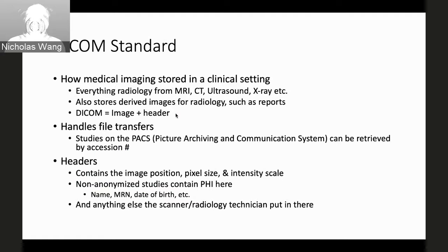All of this is great if you're a radiologist, but if you're a bioinformatician and you want to do something more involved with these studies, DICOM starts falling a little behind. These headers contain everything from where each image sits in the volume. Oftentimes in the clinical setting, they'll contain PHI, and these headers are useful but not always filled out, and so that can sometimes cause an issue.